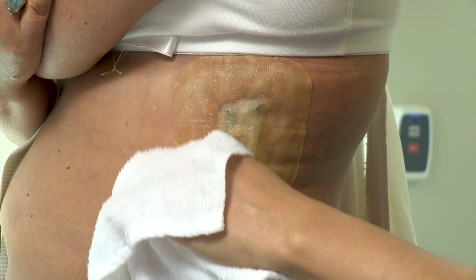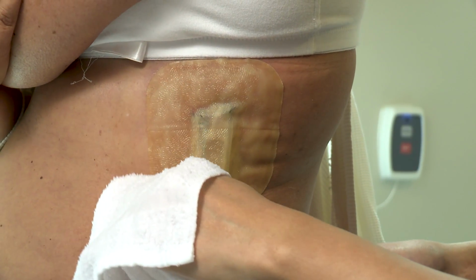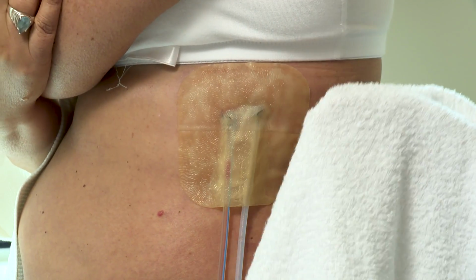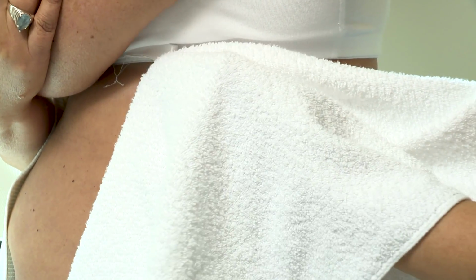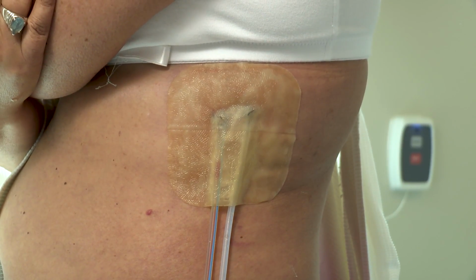If you are unable to shower, clean the area at least one time each day. Without removing the DuoDerm, gently wash the area with soap and water and rinse well. The same DuoDerm dressing stays in place over your drain insertion site until you return to see your surgeon for follow-up. Do not remove or replace any part of the DuoDerm dressing unless instructed to do so by your surgeon.